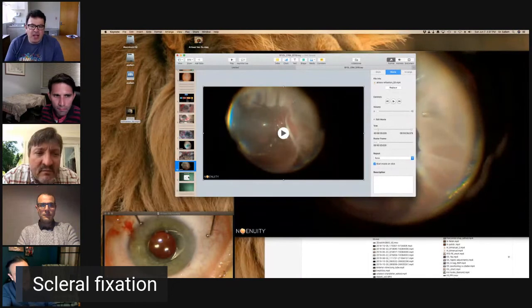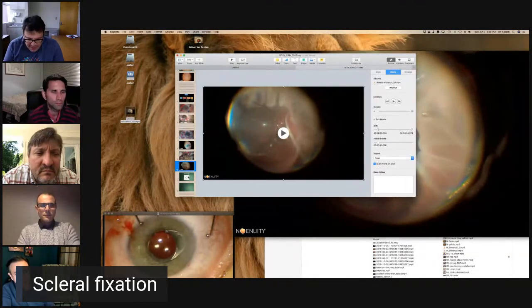So especially for those who are hearing us or watching us now, it's very good to understand all the pros and cons. And then after that, you do what works for you. 27, for example, is nicer with the hypotony. The new forceps are good, really, or you can use the flexi loop. But then dunking becomes a little bit tricky.